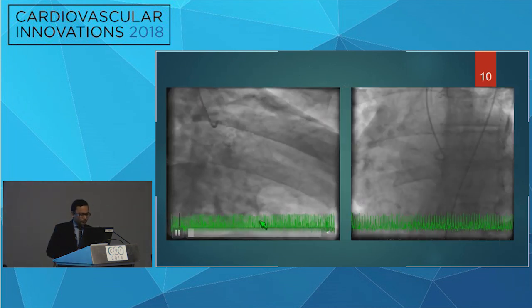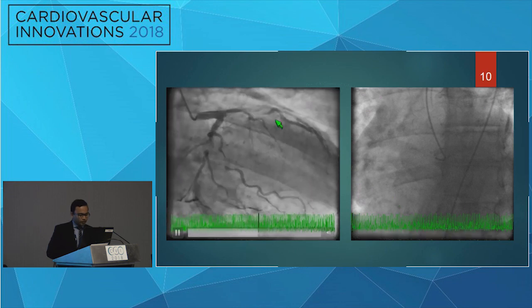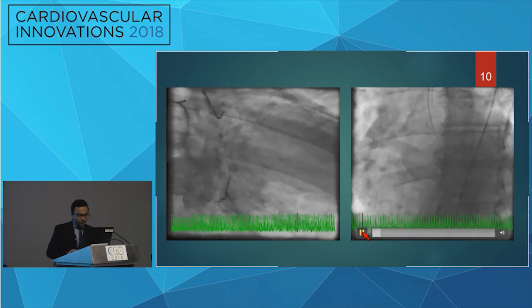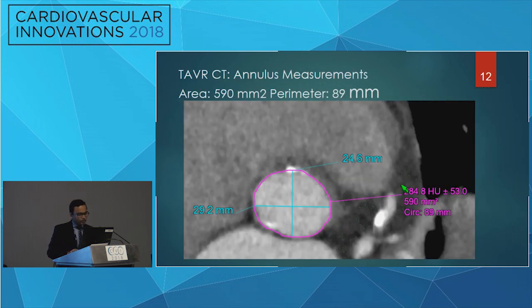And just a coronary angiogram before the procedure. Her LAD appeared to have some narrowing right there, but the RCA is CTO. And the FFR of LAD was 0.84. And then we... closure. So you can see you already start noticing, and she has no history of peripheral arterial disease, but all her vessel anatomy looking not very favorable for getting a transfemoral TAVR.